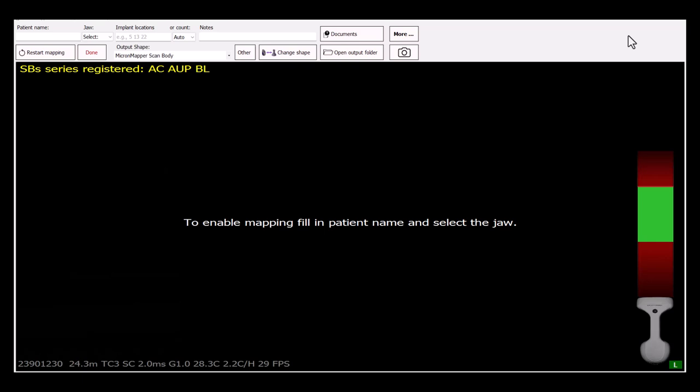To initiate FitCheck, you need to perform a photogrammetry scan as you normally would with the patient, but this time you would need to scan the prosthesis. Fill out the name and select the jaw that would match to the jaw selected for the photogrammetry scan.